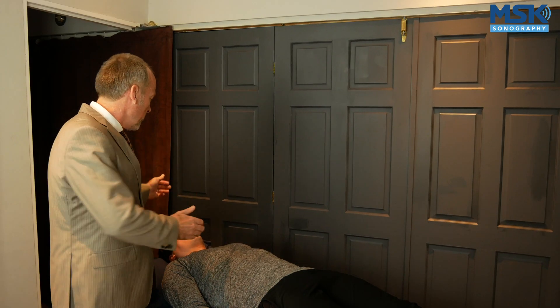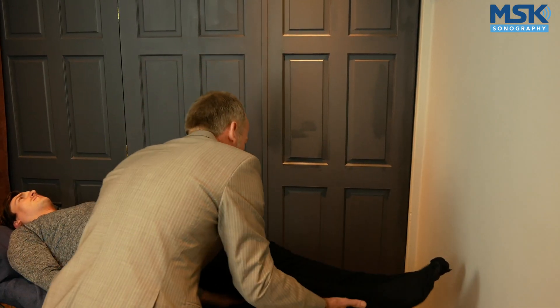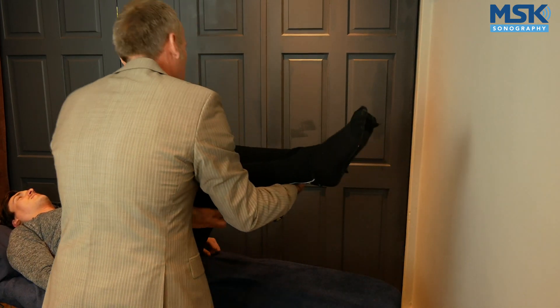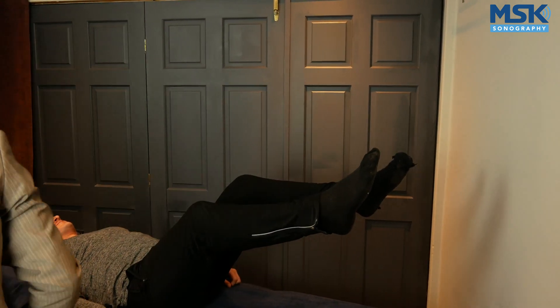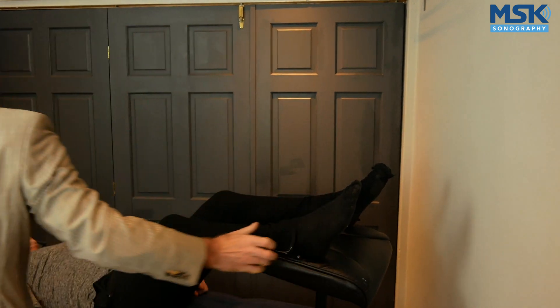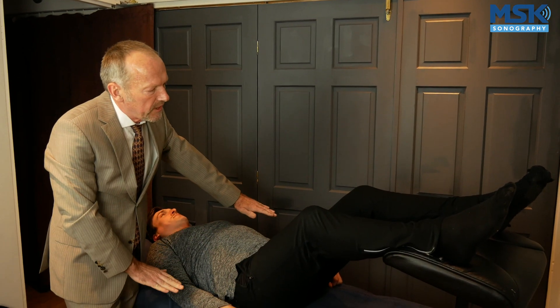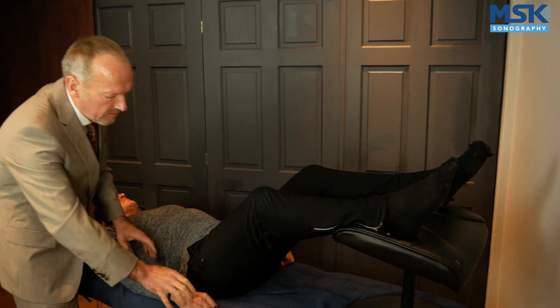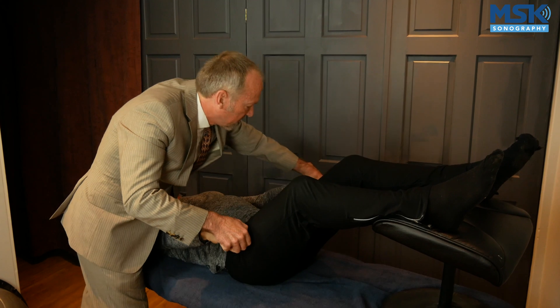With our model here representing neural tissue — nerve tissue from proximal to distal — the nerve courses from deep to superficial, represented in this fashion. The nerve also splits. The nerves rest here, and this change in course going from the deep field — the far field to the near field — occurs just before the metatarsal heads, represented by the closed fists here.